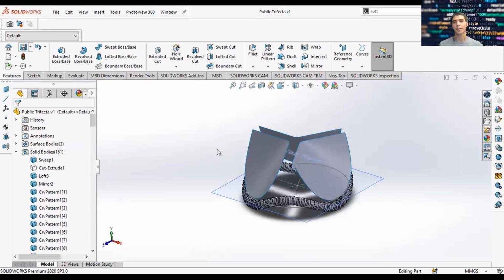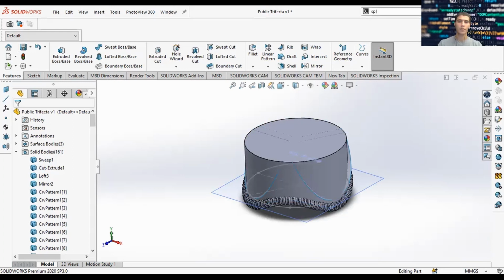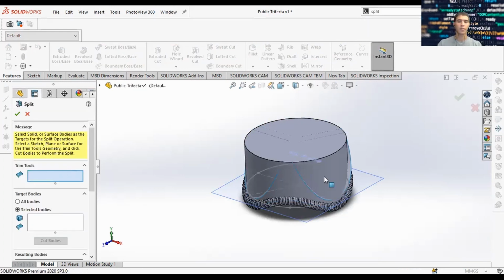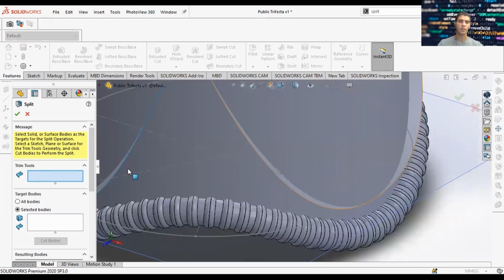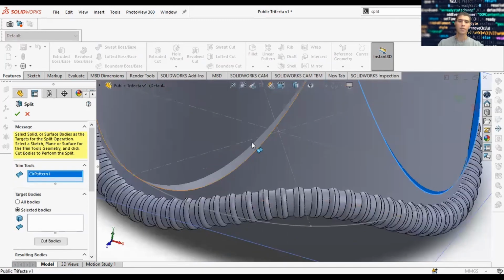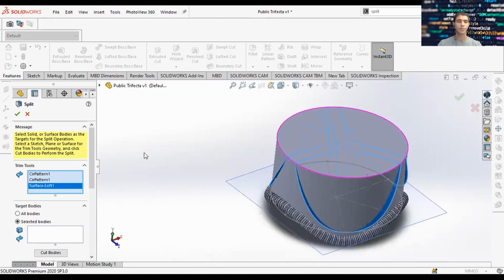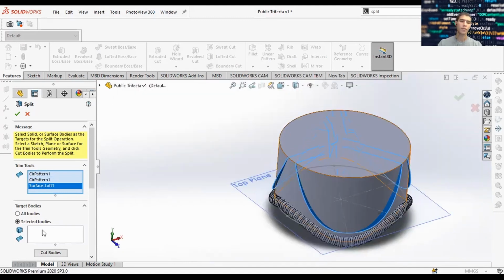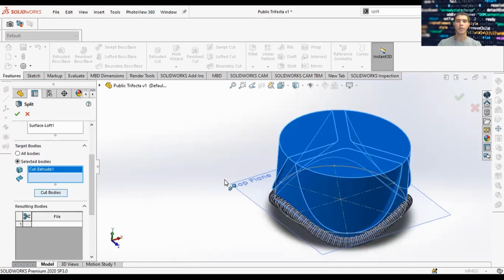So what's next? Allow me to show you one application of how you can use surface bodies to affect solid bodies, particularly as a split tool. So the surface body we just made is going to now cut the solid body of the cylinder at the contour that we're looking for. Let's go ahead and see what this looks like.